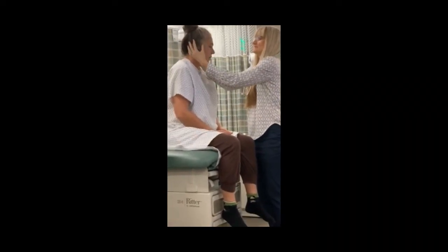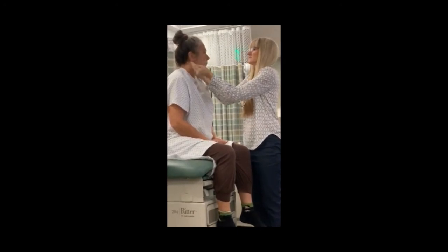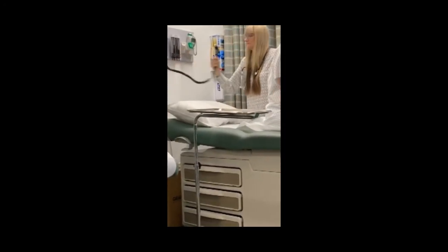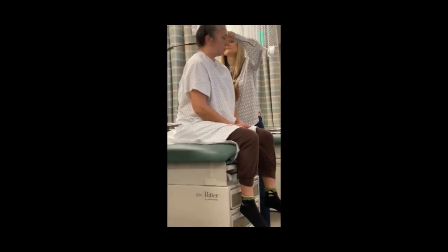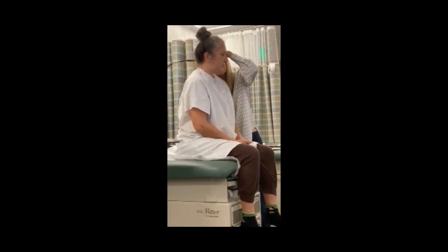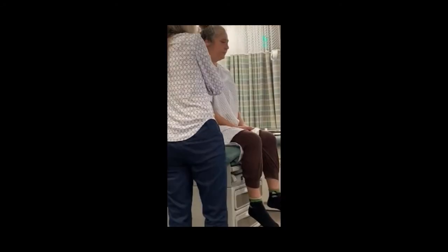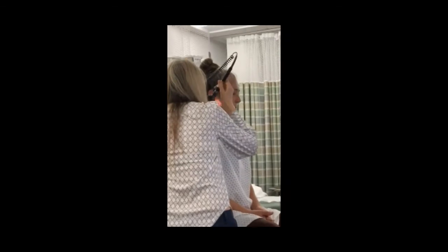In a practical clinical exam, palpate the head for any pain or tenderness. Ask about pain at various points. Check whether pulling or pushing on the ear causes pain — tenderness with traction on the ear suggests otitis externa. Look in the ear canal and note the tympanic membrane: a lovely, bright eardrum is normal.